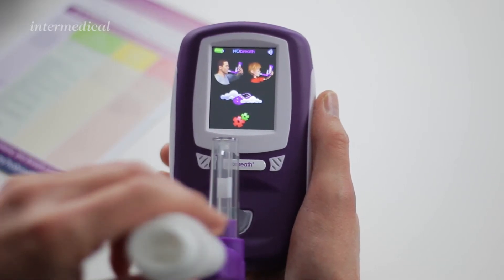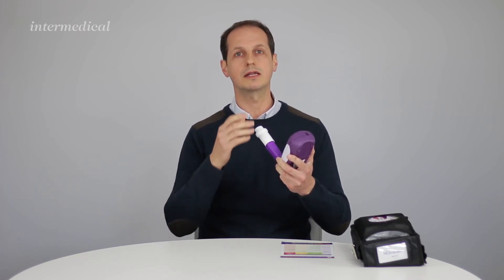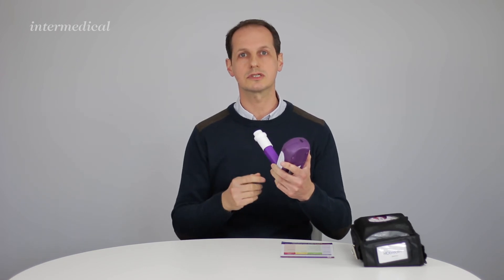I'll pop the flow indicator into the monitor and click on the adult setting. When I hear a beep I'm going to take a full breath in and hold my breath. When I hear a double beep I'm going to start blowing out — you blow out for 12 seconds. There's an indicator that comes up on the screen as you'll see in a moment.